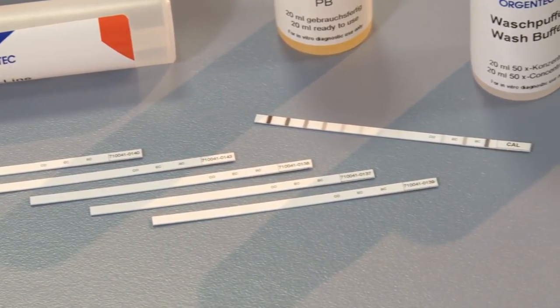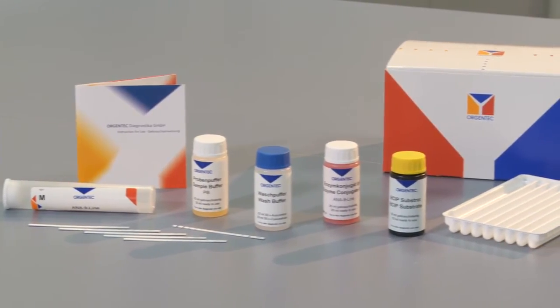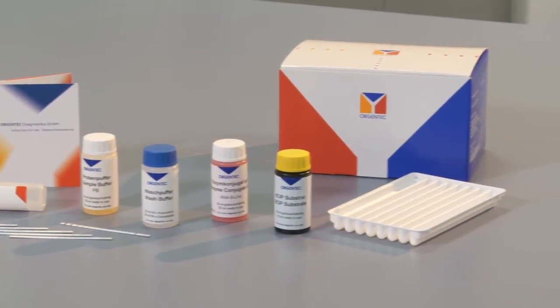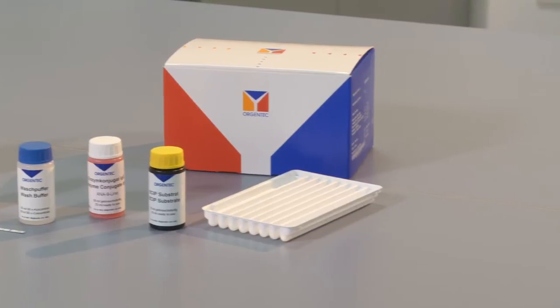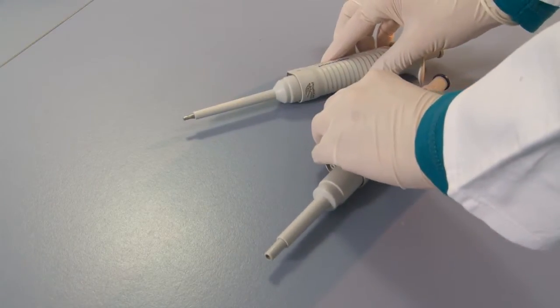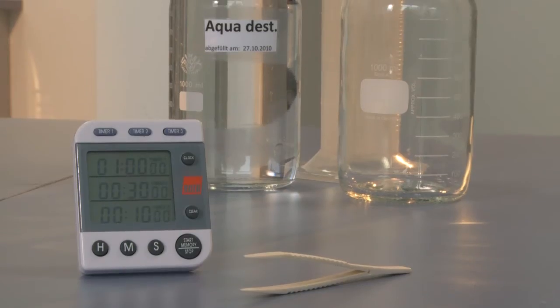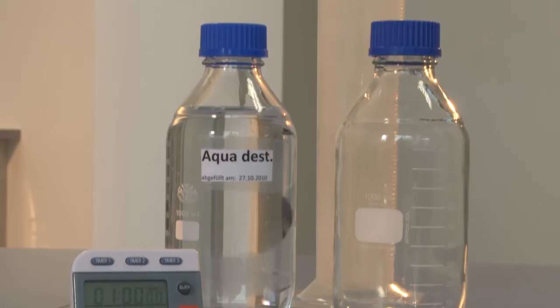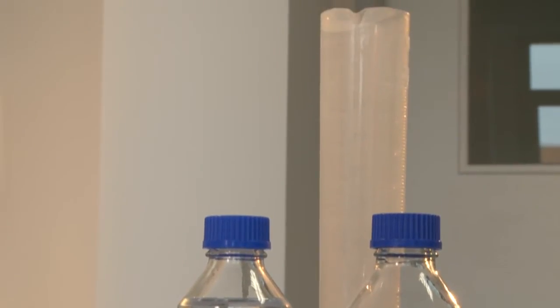Immunoblots are easy to carry out and can be used to detect several antibodies simultaneously. They are well suited for differentiating analyses after a positive screening test and provide a semi-quantitative result. Every laboratory with standard basic equipment can easily and quickly carry out immunoblots without complex preparation. Knowledge of special techniques and technically demanding instruments are not required.